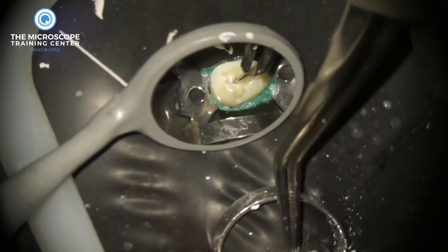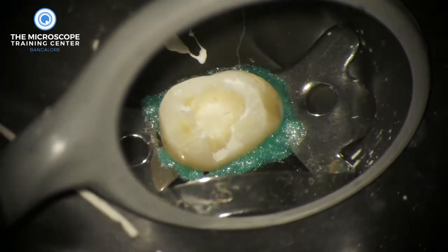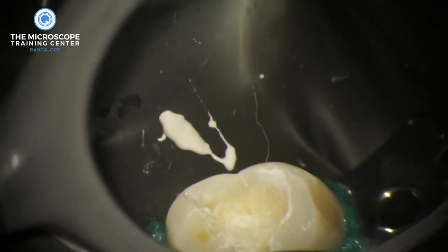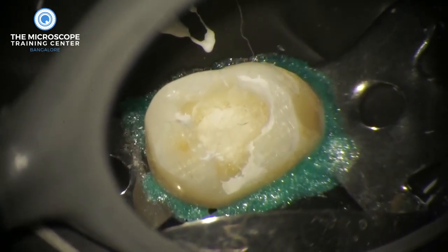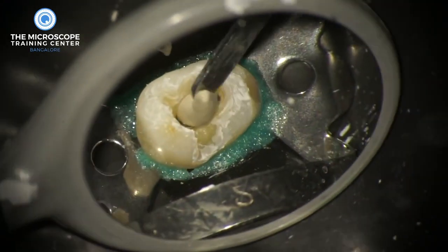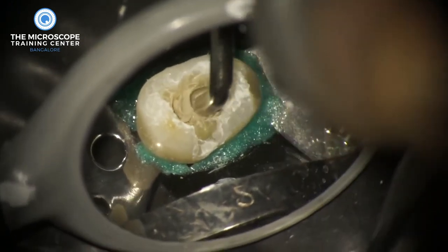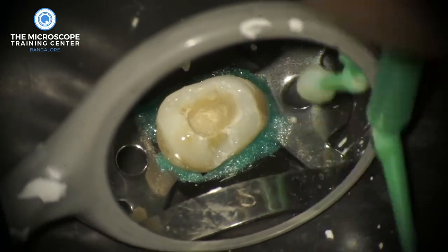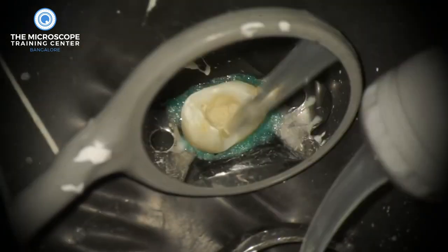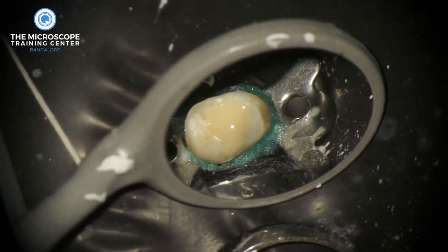A lot of people like to use cotton after this — plugging cotton around the calcium hydroxide and covering with temporary material. We don't like to use cotton because when you zoom in, you can see those cotton fibers tend to stick out and act as capillary tubes to draw saliva into the canal, contaminating it. Instead, we plug Cavit G directly above the calcium hydroxide straight into the canal, applying pressure with a plastic filling instrument. This can be easily removed with ultrasonics during the second visit. We then apply pressure with a wet micro brush to plug the Cavit into the canal, and cover the Cavit with glass ionomer cement as a temporary filling material.